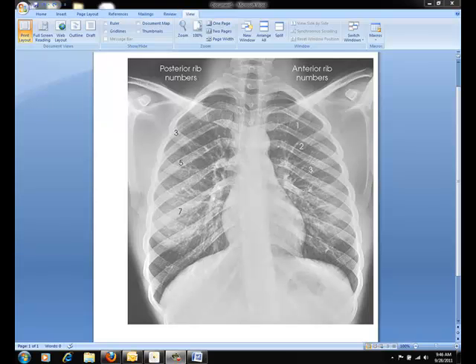Today we're talking about the AP projection of the ribs. Typically for this, you'd like to use a 14x17 cassette placed portrait, with the IR approximately 1.5 inches above the upper border of the relaxed shoulders. For positioning of the patient, rest the hands and palms outward against the hips, and slightly rotate the shoulders forward to draw the scapula away from the rib cage.